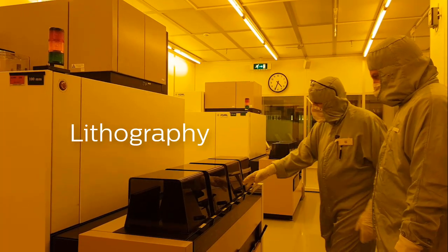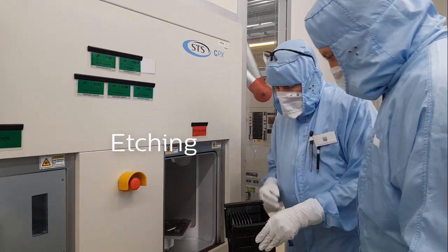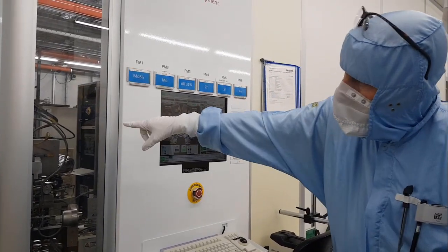To make a MEMS we use lithography to project the image, etching to make microstructures by removing all material, and deposition of metals and dielectric materials. We make all kinds of MEMS, like ultrasound chips, laser scanners and bio MEMS.